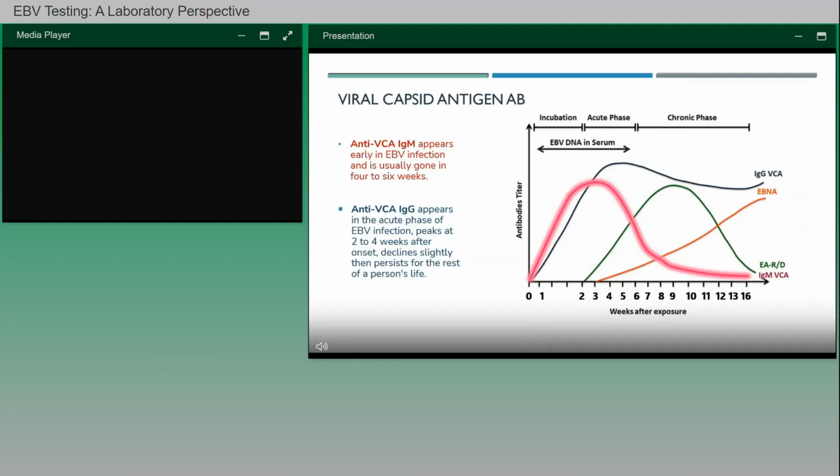Okay. It's also important to note that these serologic marker time graphs are not standardized. If you search for a graph like this, where serologic markers over time for EBV, you're going to see x-axes that are significantly different. You'll find lots of different images with different x-axes, and that's just the way it is. None of these follow very strict guidelines, right? So I've actually made this x-axis nonlinear to drive home that point that these timelines are variable. So just be aware that no two graphs plotting this will look exactly the same, but these are general trends that you see.